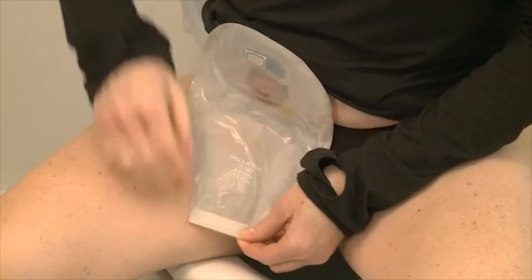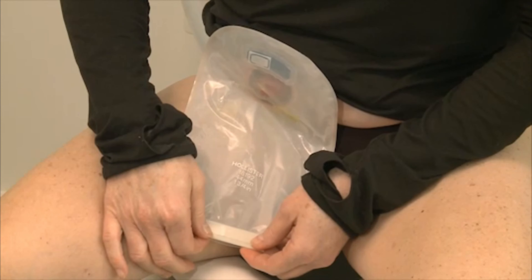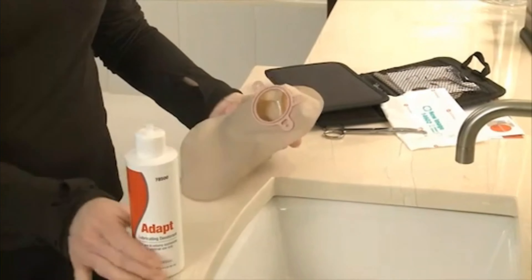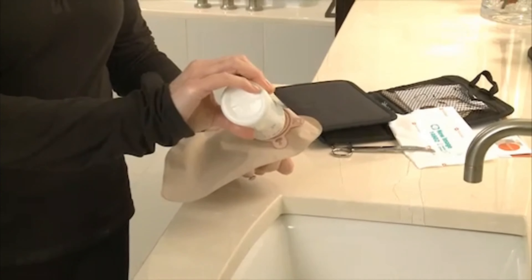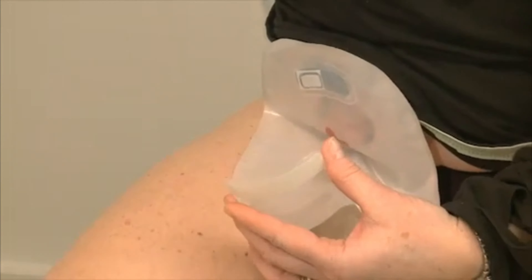Don't worry if Adapt Lubricating Deodorant comes in contact with your stoma — it is safe and will not harm your stoma. The product can be used with either closed or drainable pouches.